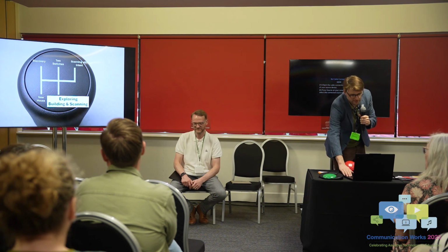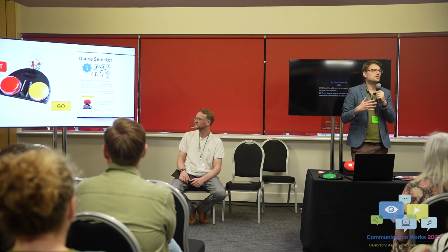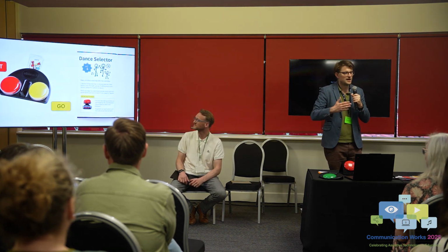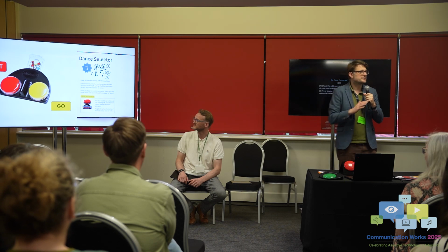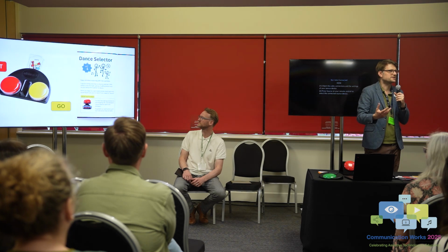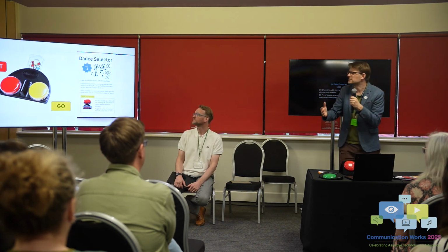So at this stage we are exploring building and scanning. You could call it error-free or failure-free, but this is where people are learning to build and learning to scan, but there's no intent. You're not giving somebody a communication aid where they haven't learned to scan and then they're going to be saying things that are not intentional, if all that makes sense.